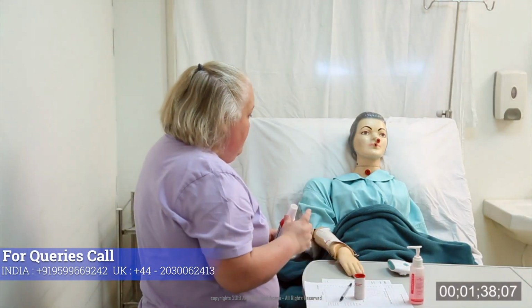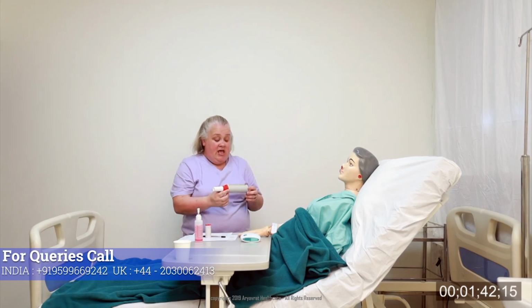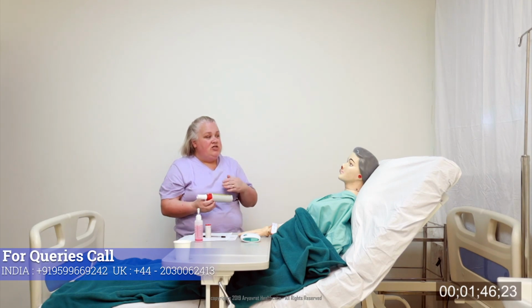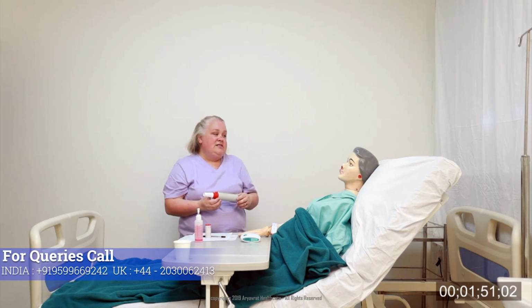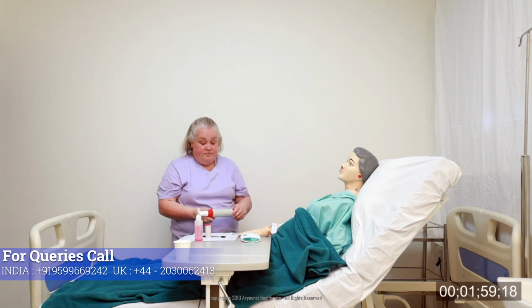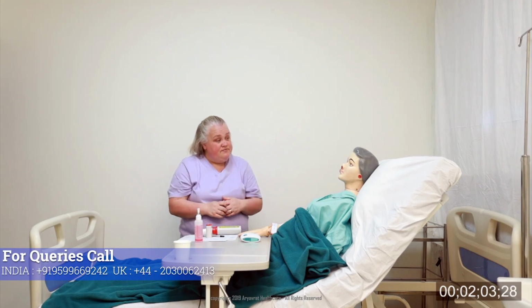So this is essentially a basic tool to measure your lung capacity, so how much you can fill your lungs with air and expel that air, and to see whether or not the medication you're using for your asthma, so your inhalers, is sufficient for you. Is that okay? Okay. So first of all, have you had your inhalers this morning?